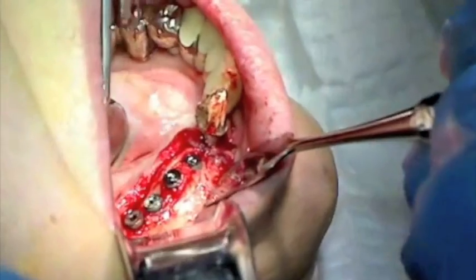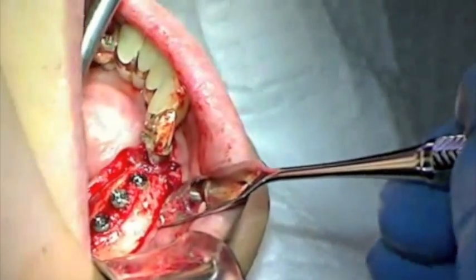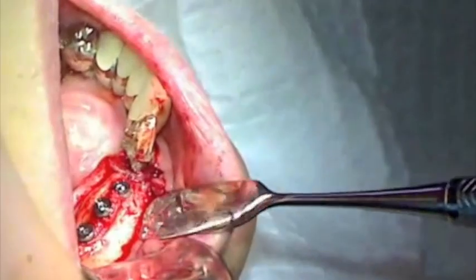Prior to closure, each implant is evaluated for proper positioning. Alterations in implant position can be made at this time.